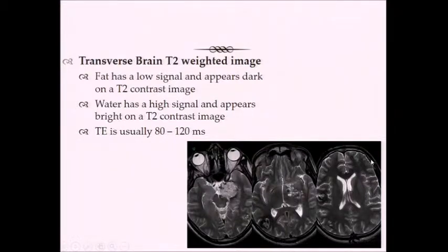So if you look at the signal associated with subcutaneous tissue, and again you can see it here, it's probably better to see it here because it's adjacent to the fluid. So this is fat sitting in the retroorbital region, and then here's water sitting within the globe, within the eye itself. So what I'm saying is that the fat has a lower signal intensity than fluid.